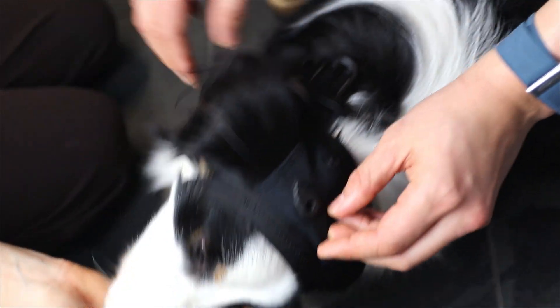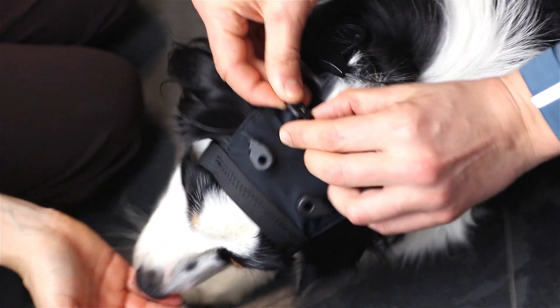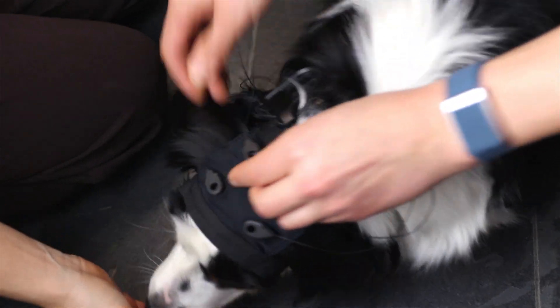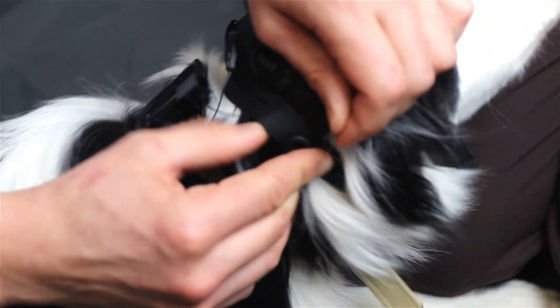Attach all clip connectors to the hybrid electrodes in the cap, making sure they are properly positioned. The ground electrode should be placed behind the ear.